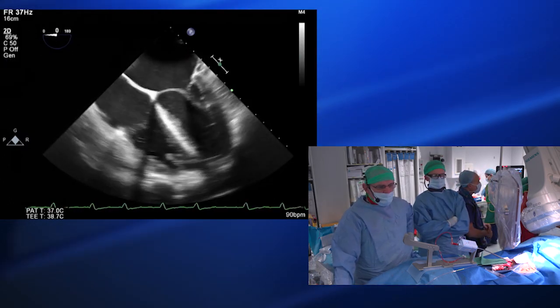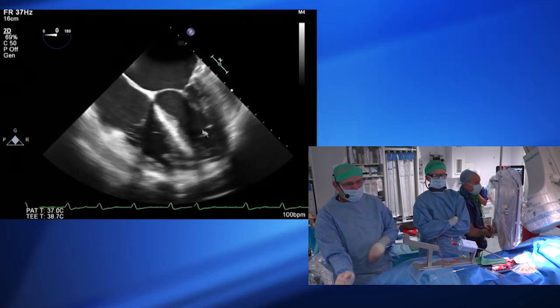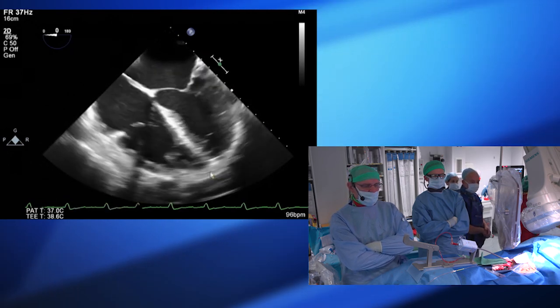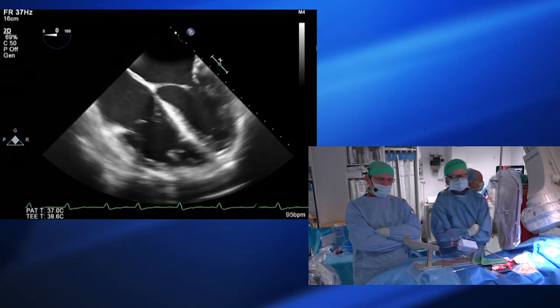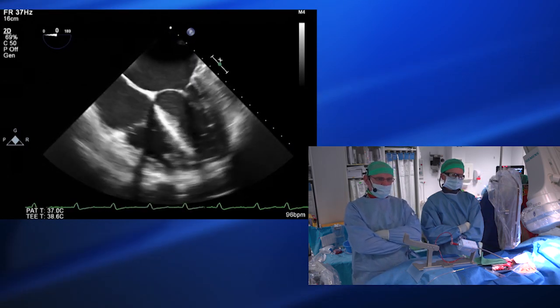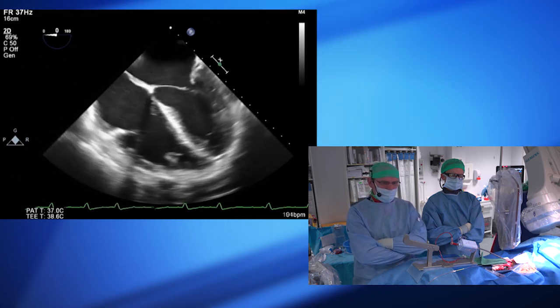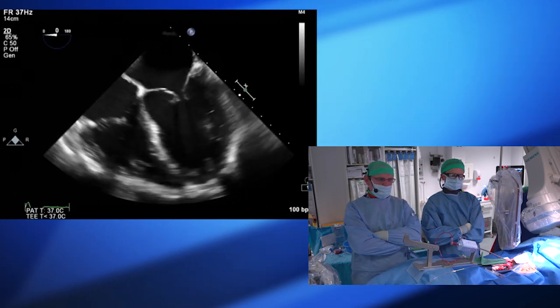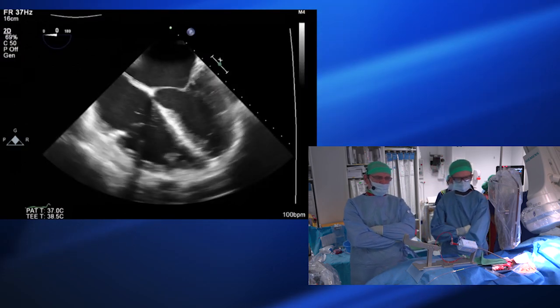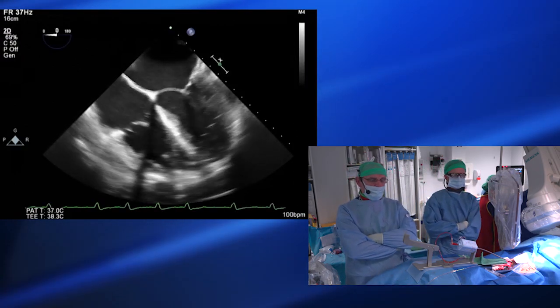I think the ventricle looks a bit happier already — there's definitely a little bit more contraction. Going back to play the original picture just so we can be sure. That's where we started — and that's where we are now. I dare say it's even come down in size a little bit, which shows you the acute physiology. Patients tolerate this procedure very well, seemingly.